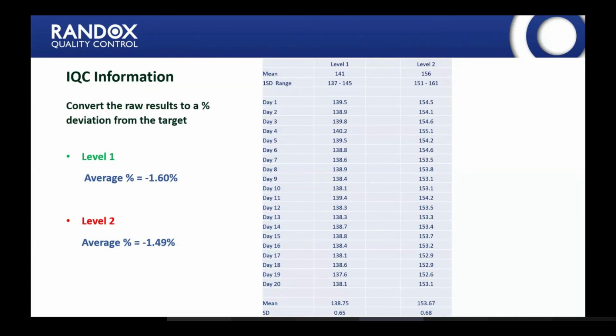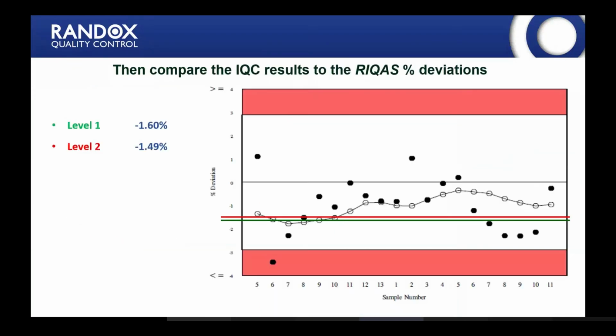So whenever we looked at the two levels, the average deviation for level 1 was minus 1.6%, and for level 2 was minus 1.49%. Now, when we plot that on the EQA report, here we go, 1.6 and 1.49 for the two levels. So this is what the average internal QC level is like. And as you can see, their EQA is actually performing very well. However, it is true that they are running with a negative bias.